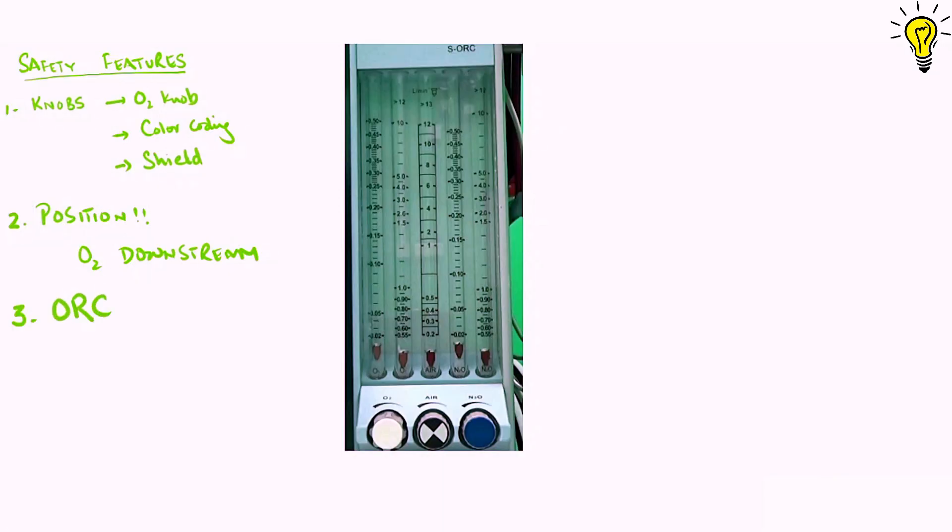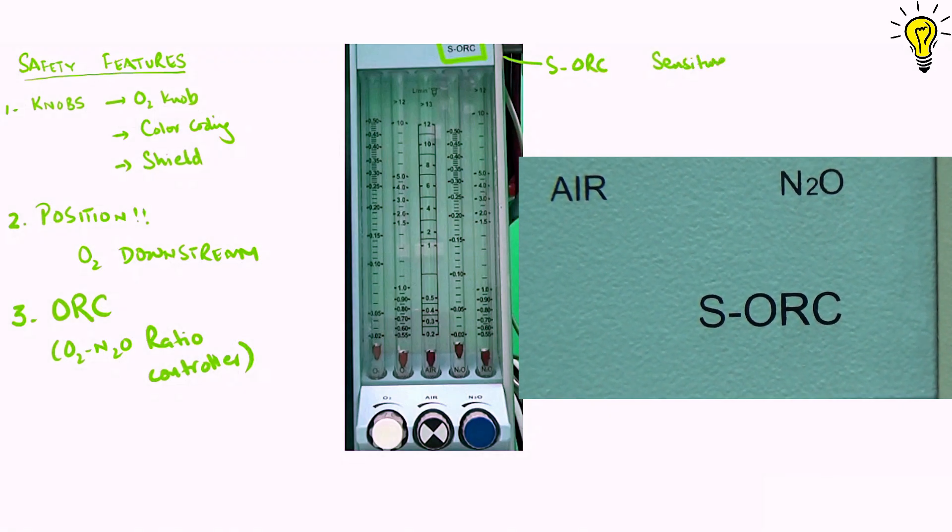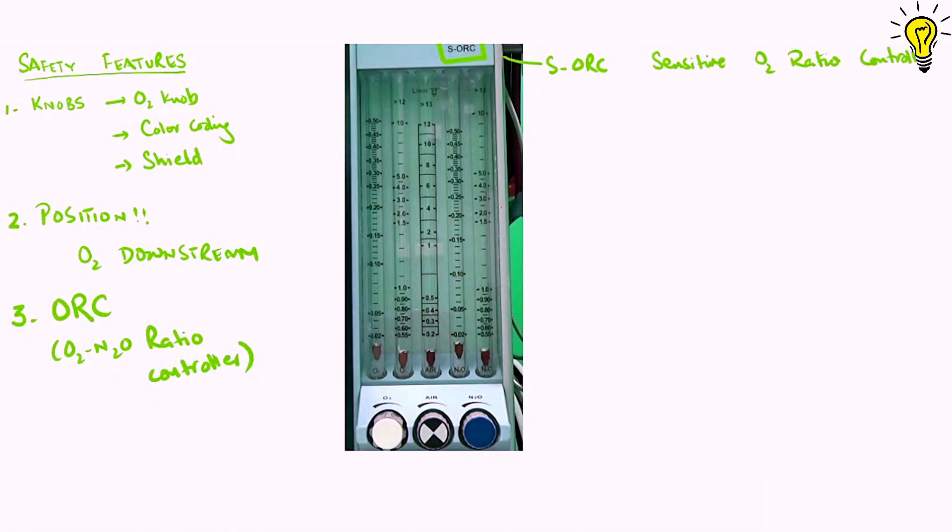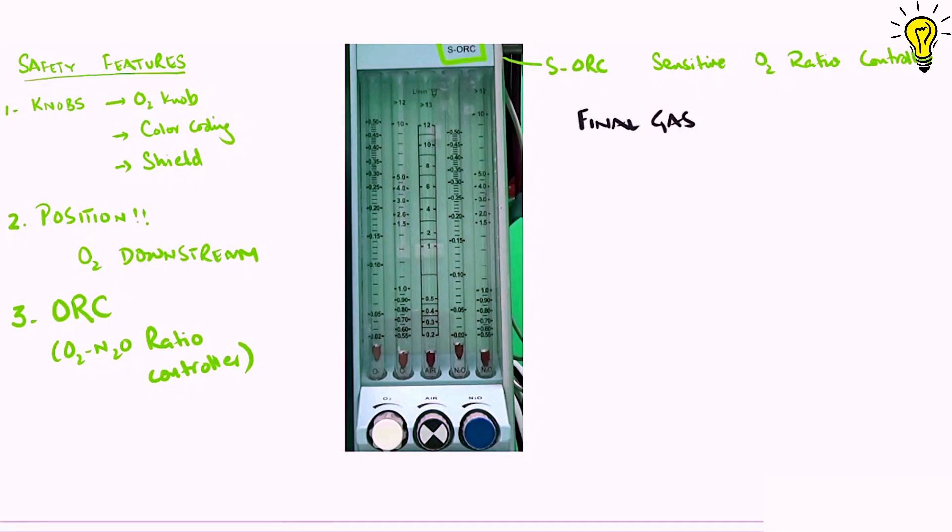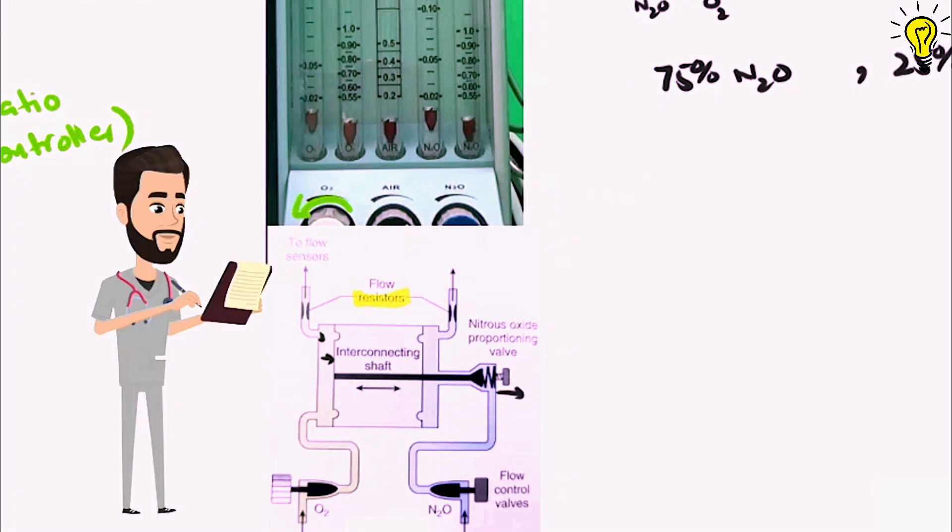The final safety feature is my favorite one. It's very witty, very intelligent. The ORC or oxygen nitrous oxide ratio controller. Now you can see on this Dragger machine, it is written SORC meaning sensitive oxygen ratio controller. The ORC in any machine ensures the final gas output should have at least 25% oxygen fraction. It ensures that this mixture of oxygen and nitrous at minimum 3 ratio 1. In simple terms, 25% of the mixture should be oxygen at all cost. So how does it do it? Let's see how SORC of Dragger has done it.